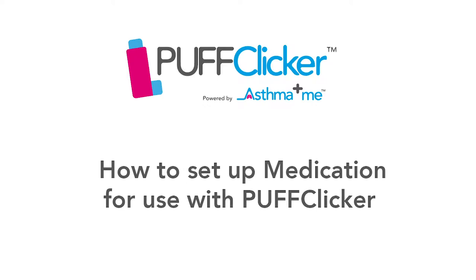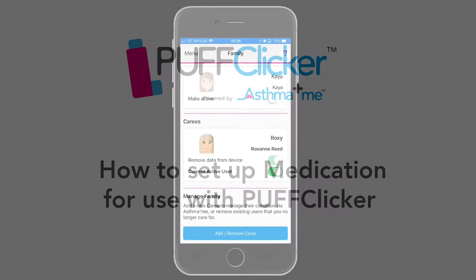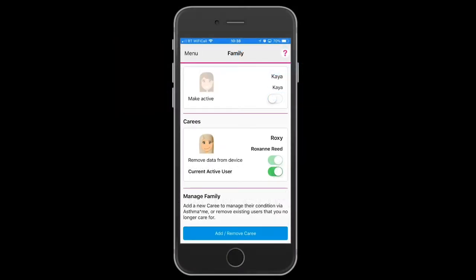Setting up a medication for use with your Puff Clicker. Either make the carer or carey active. We will be adding a medication for the carey.